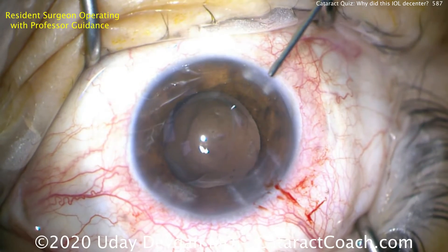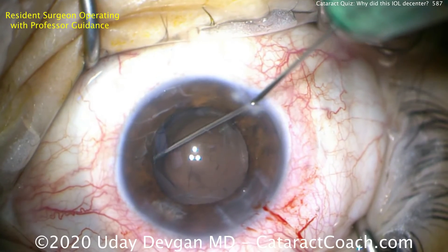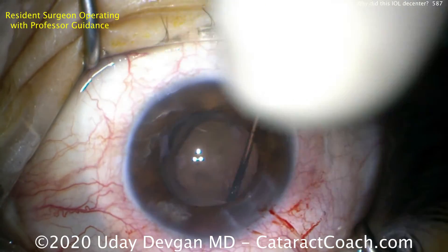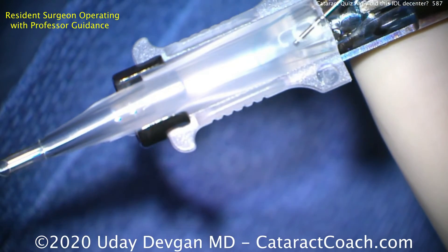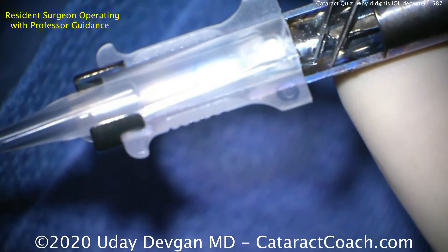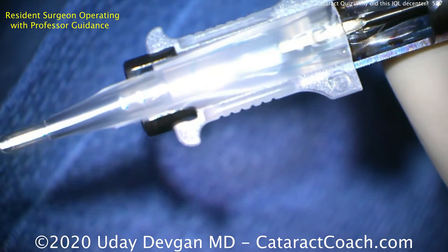Let's remove it. Now let's make sure the capsular bag is fully inflated, and we're going to put in our new lens in the capsular bag completely. We want to avoid sulcus placement if we have an intact capsular bag, such as this case. There's the new three-piece lens, very carefully loaded appropriately — that's a C cartridge. We're just going to make sure this trailing haptic is over the edge of the injector so it doesn't get caught in the plunger.